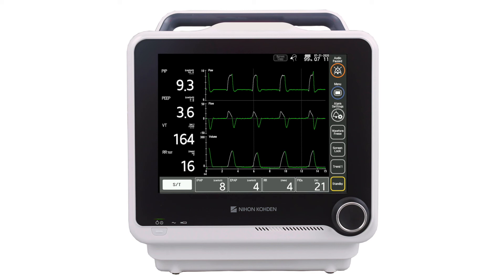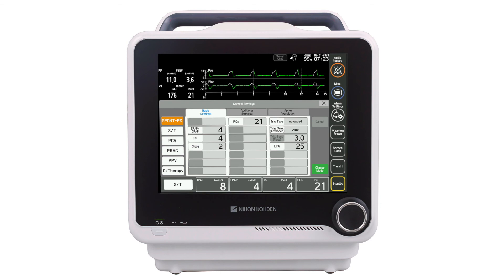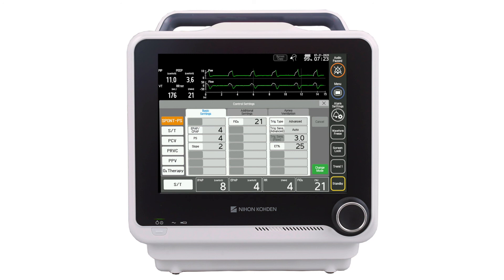To change the ventilation mode or access additional control settings, touch the change mode button. When changing ventilation mode, the clinician selects the new mode, presets the settings for the new mode, then touches the change mode button to confirm the start of the new mode. From this window, clinicians can also access additional ventilation controls by selecting the additional settings tab or tabs that are available.